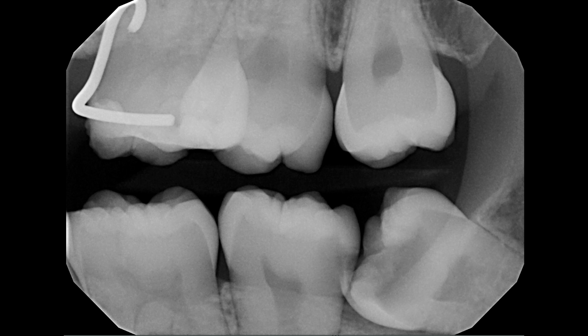This is a patient that presented with severe pain in the lower left jaw. On the radiograph we can see an impacted wisdom tooth with a large cavity pressing up against the second molar, which also has a significant cavity. There is an area between the teeth that cannot be cleaned with a toothbrush, so it collects food and plaque, causing decay — requiring surgical removal of the wisdom tooth and restoration of the second molar.